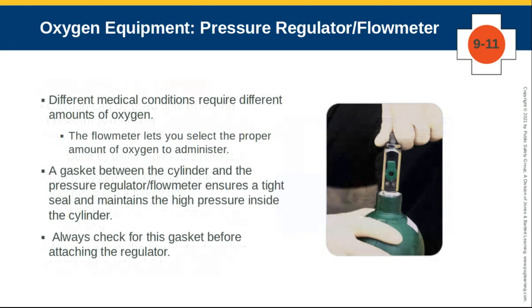Now, whether we deliver it at 2 liters per minute or 15 liters per minute depends on the patient's condition and the device that we use.